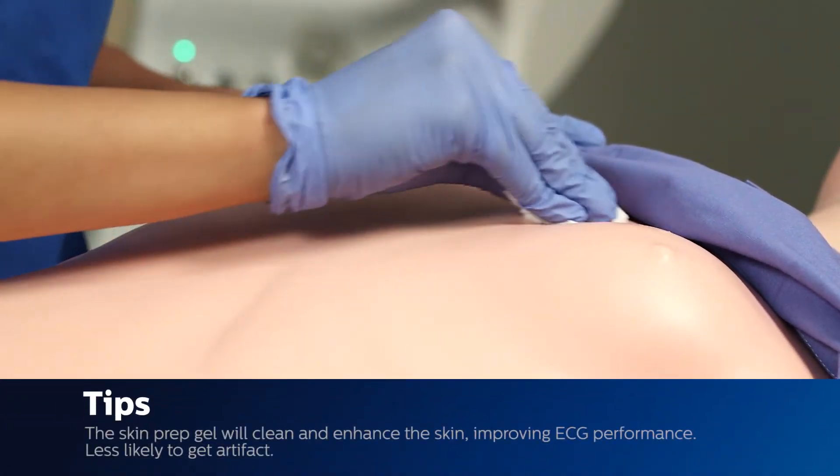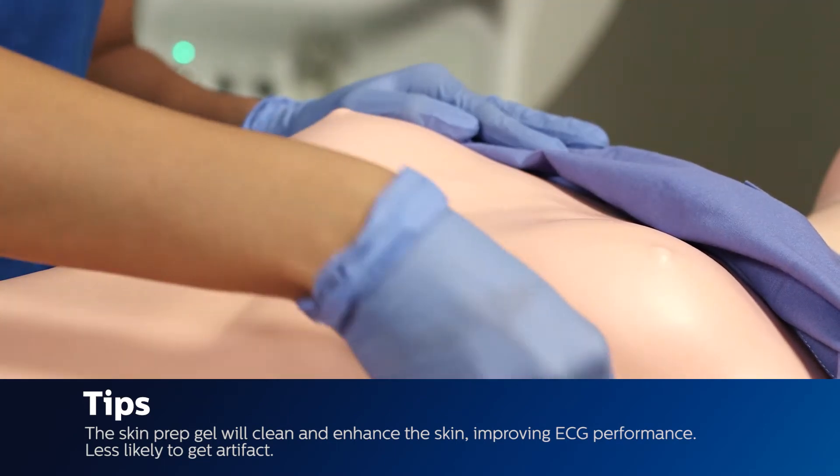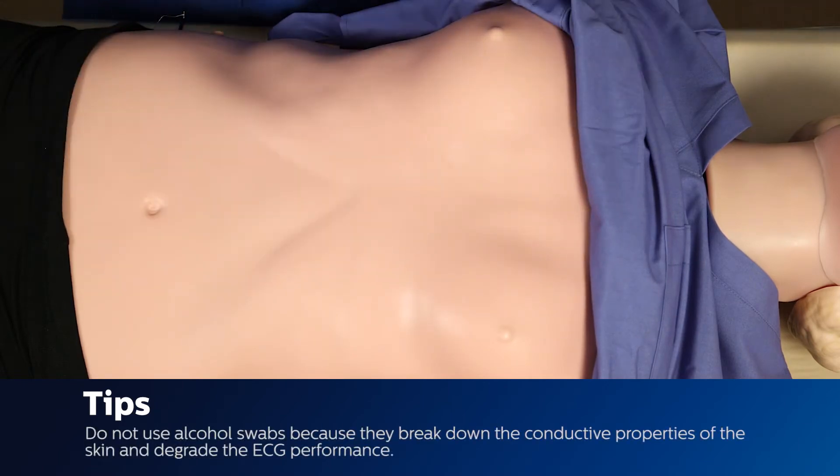The skin prep gel will clean and enhance the skin, which will improve ECG performance — you will be less likely to get artifact. Note that alcohol swabs break down the conductive properties of the skin and degrade ECG performance.